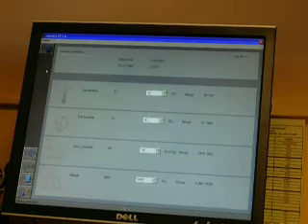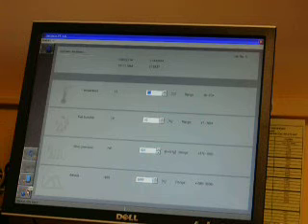You want to make sure they're the conditions of the current day. Our barometric pressure here in Denver is 623 today. Our current relative humidity is 19%, and our current temperature is 21. It also has a setting for altitude. You want to make sure that is correct for your particular city. Once the ambient conditions are set, it's F12 to exit.